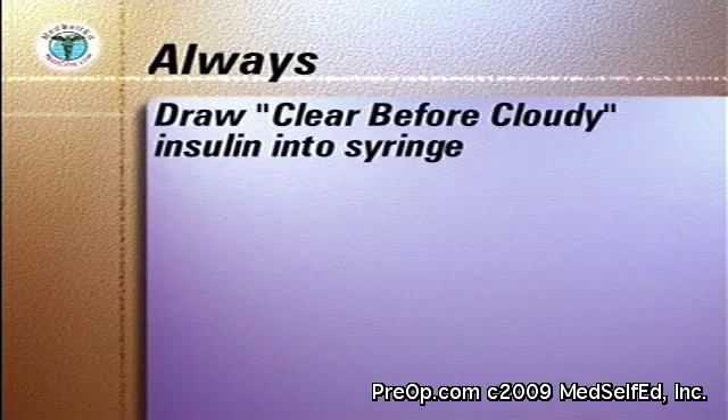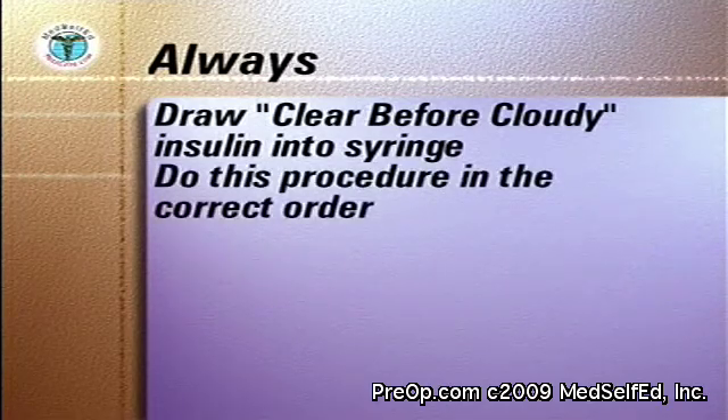Always draw clear before cloudy insulin into the syringe. This is to prevent cloudy insulin from entering the clear insulin bottle. Always do this procedure in the correct order, as shown in the following sequence.